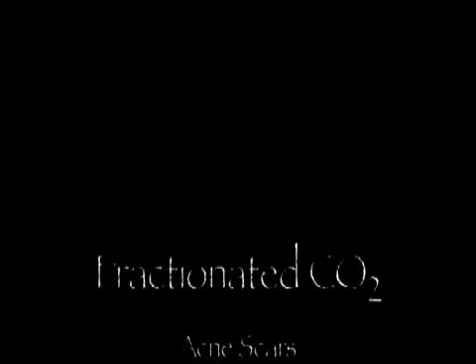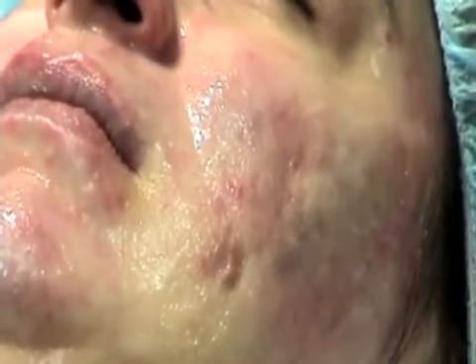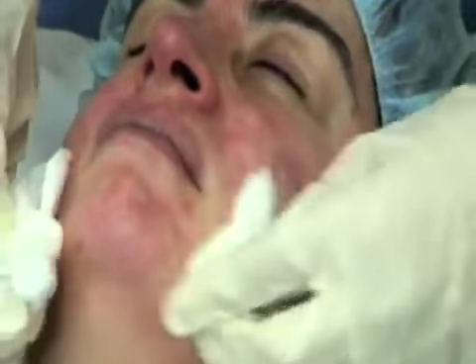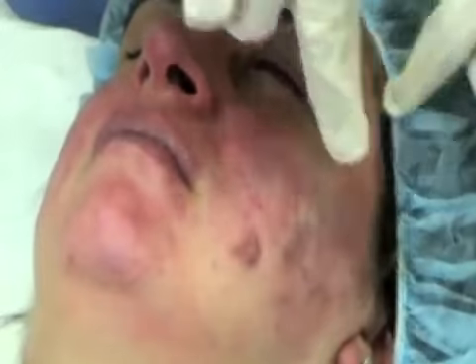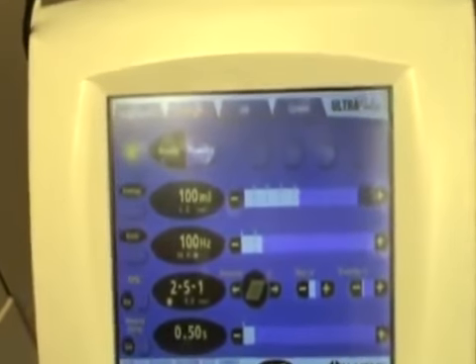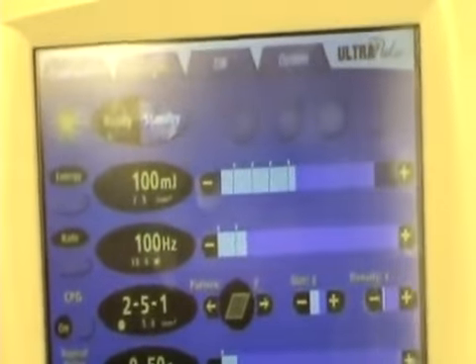Similar to fractionated non-ablative lasers, fractionated ablative lasers, such as the CO2 and erbium, ablate only a tiny portion of the skin at each treatment. The skin is first treated with an anesthetic cream, usually left in place for approximately 1 hour. The area is then anesthetized with local blocks and in some cases sedation. Parameters are adjusted to achieve the desired depth and density of the treatment.